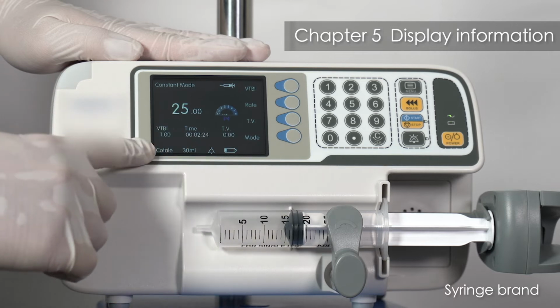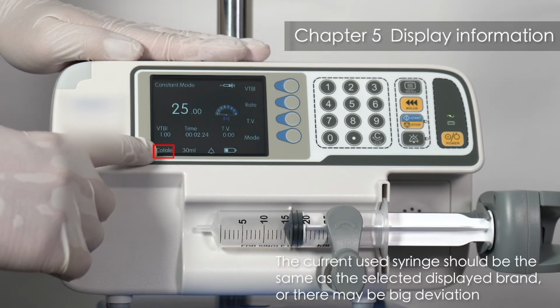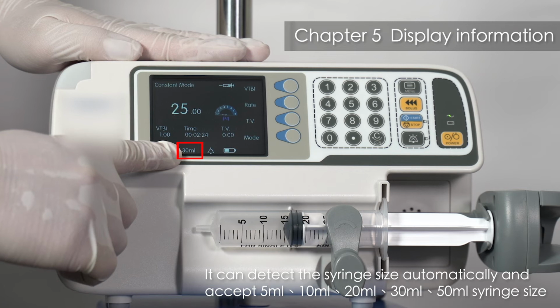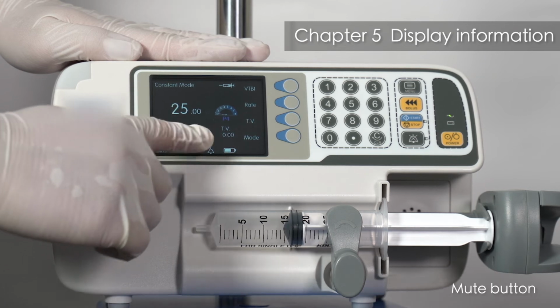Syringe brand. The current used syringe should be the same as the selected display brand, or there may be big deviation. Syringe size. It can detect the syringe size automatically and accept 5 ml, 10 ml, 20 ml, 30 ml, 50 ml syringe size. Mute button.